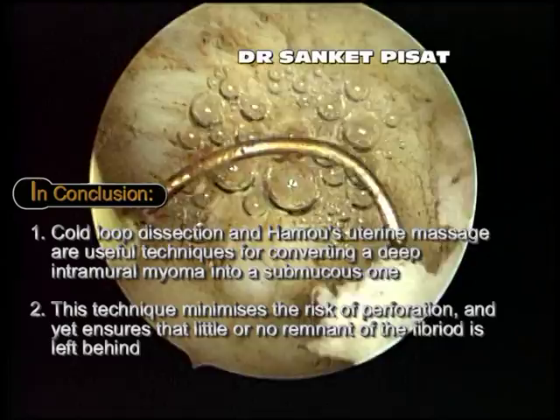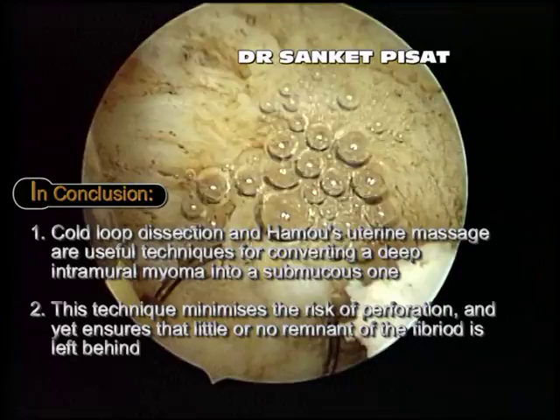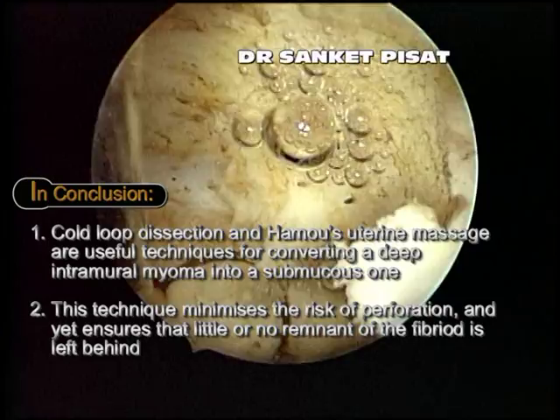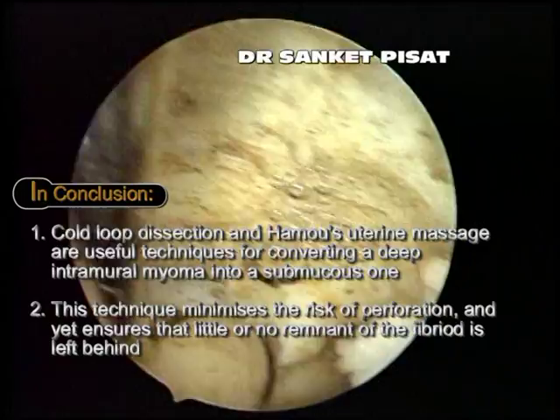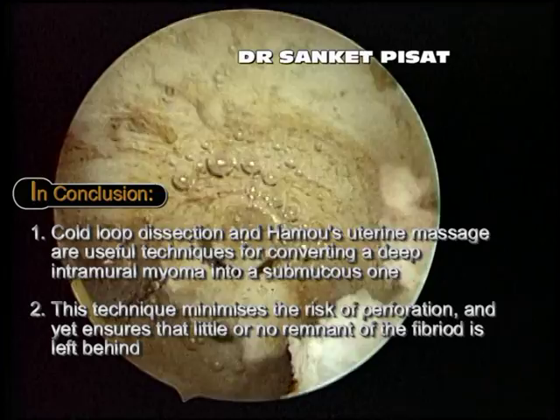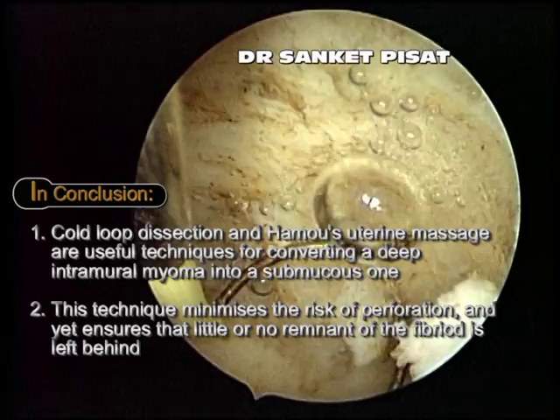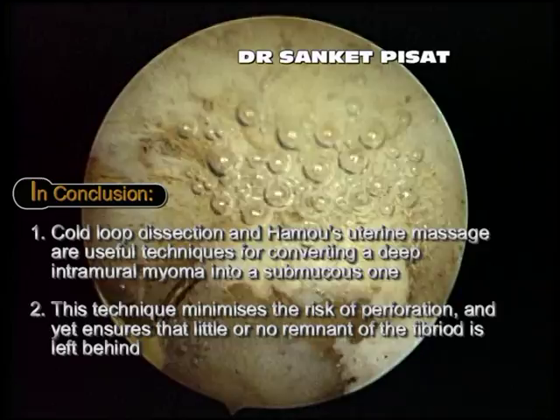In conclusion, cold loop dissection and Hamo's uterine massage are useful techniques for converting a deep intramural myoma into a submucous one. This technique minimizes the risk of perforation and yet ensures that little or no remnant of the fibroid is left behind. Using a combination of these techniques, the surgeon can convert a deep intramural myoma into a submucous myoma, thereby making resection easier, safer and quicker. As you can see, most of the fibroid bits have been removed. The last bit of the fibroid has now been excised. Thank you so much for your patience.